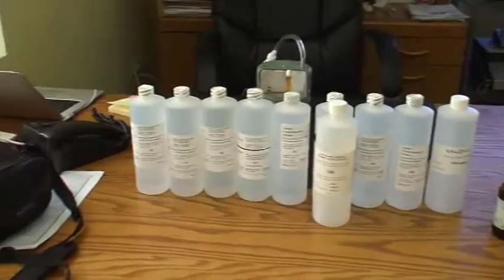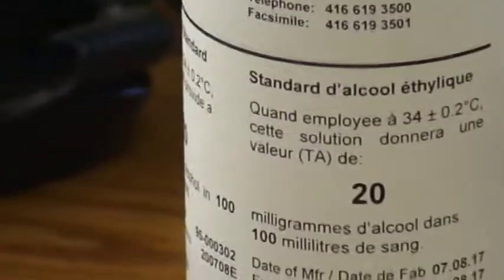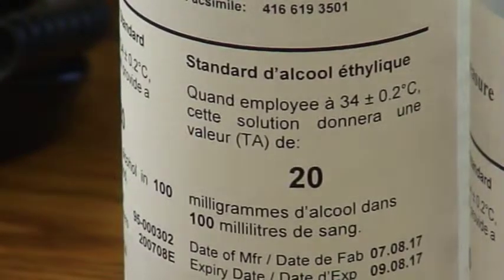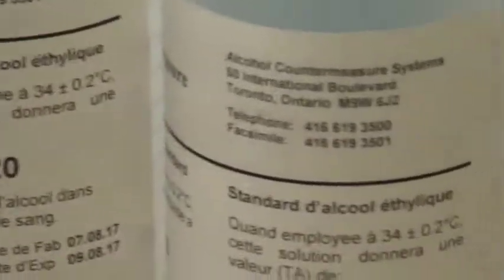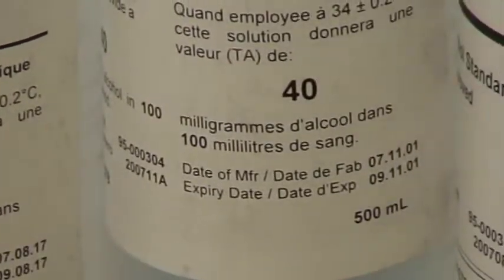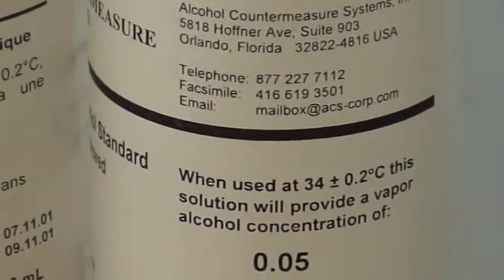So for example, if we look at the bottle of 20 solution, it says right on it that the standard is only applicable if it's used at 34 plus or minus 0.2 degrees Celsius. The same thing with the 30 solution, with the 40 solution, the same thing with the 50 solution.